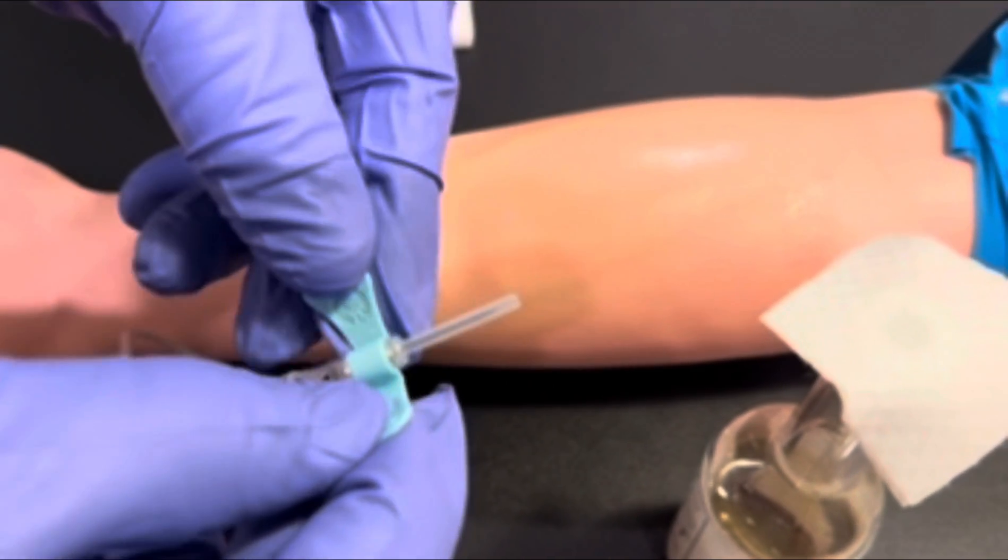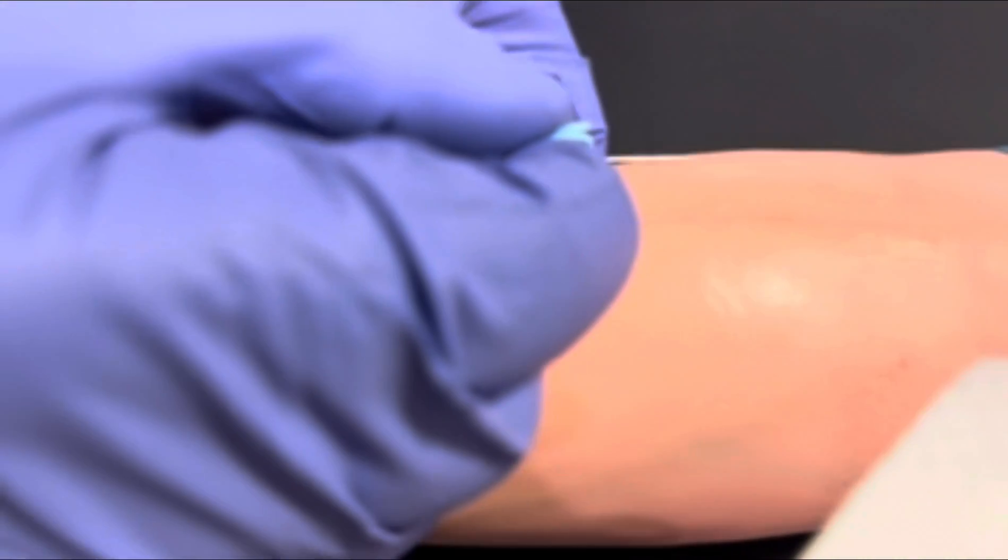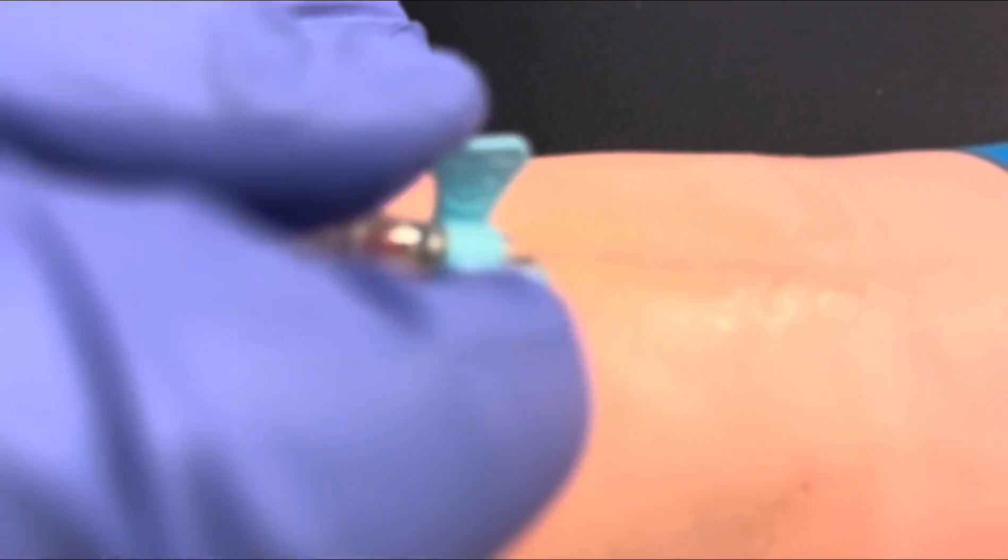Reapply your tourniquet. Prepare for the venipuncture procedure. Insert the needle at a 5 to 10 degree angle of insertion.